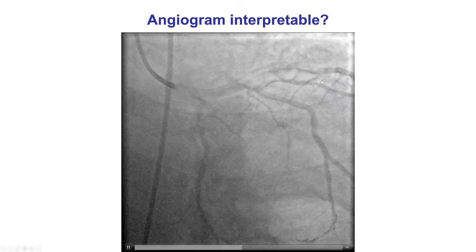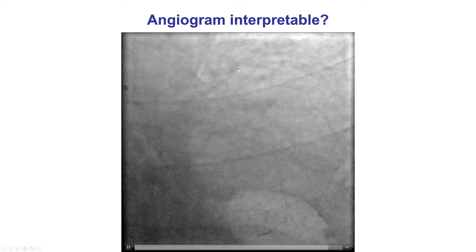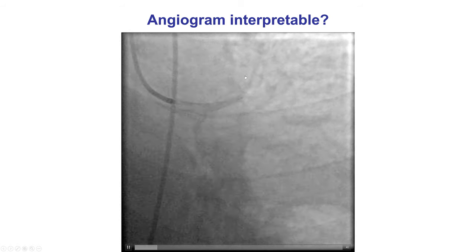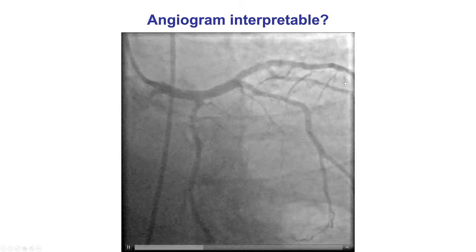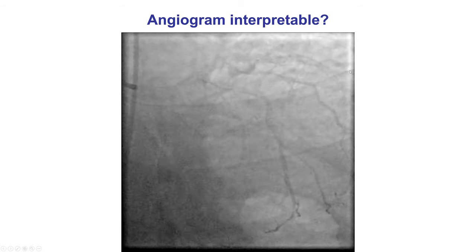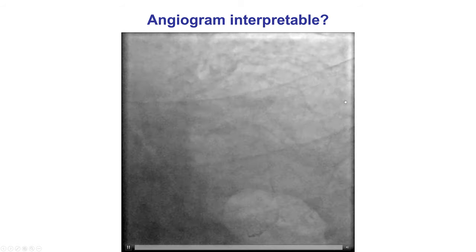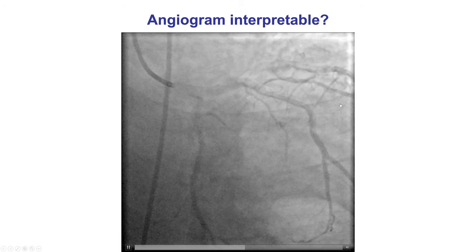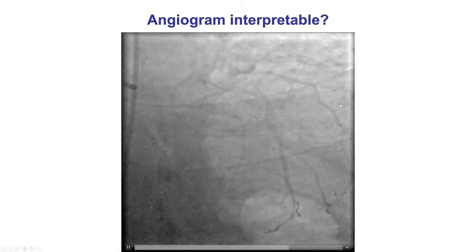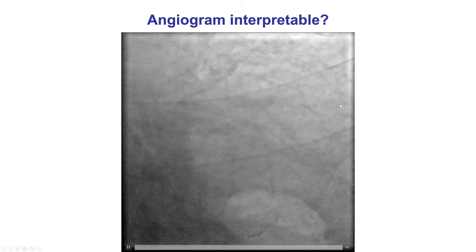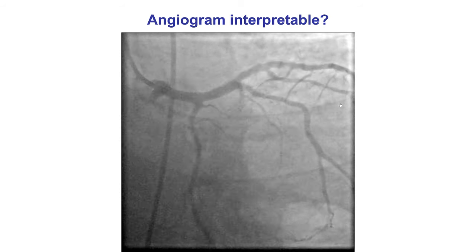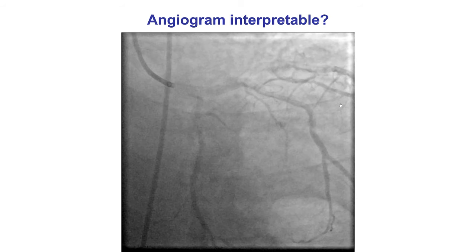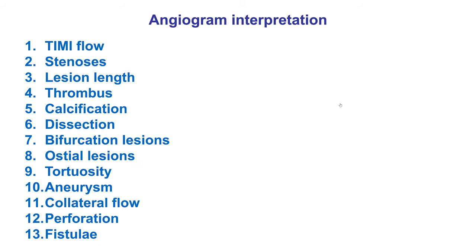Here is an example where the visualization and opacification are poor, and the LAD is cut out, so we cannot provide an assessment of the mid and distal LAD. Moreover, each coronary artery should be assessed in at least two orthogonal projections, which will be discussed in more detail later on.